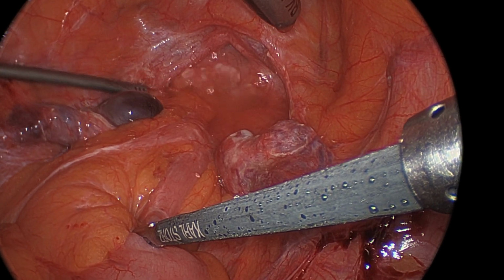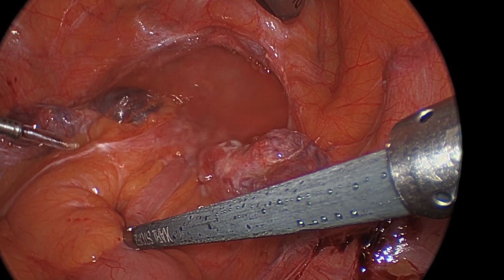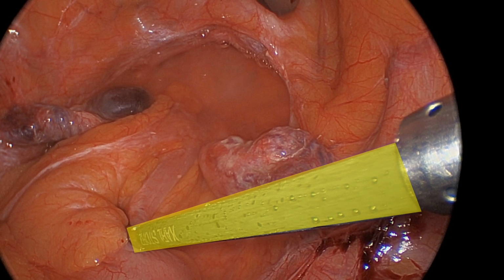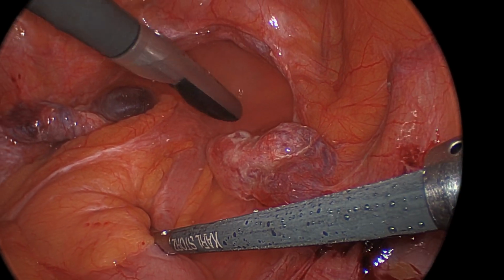The pelvis was irrigated with fluid to minimize artifact. Simultaneously, the bowel was filled with sterile water using a 14 French catheter, and an Alice grasper was placed more cephalad to ensure the rectal fluid remained within the area of interest. These techniques allowed for the establishment of an appropriate acoustic window.